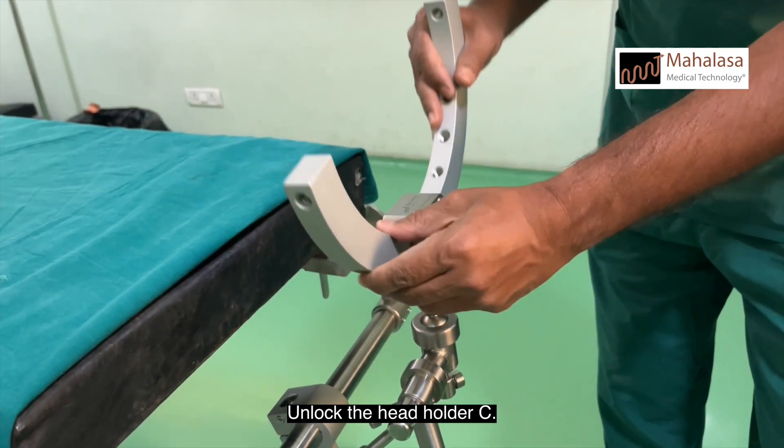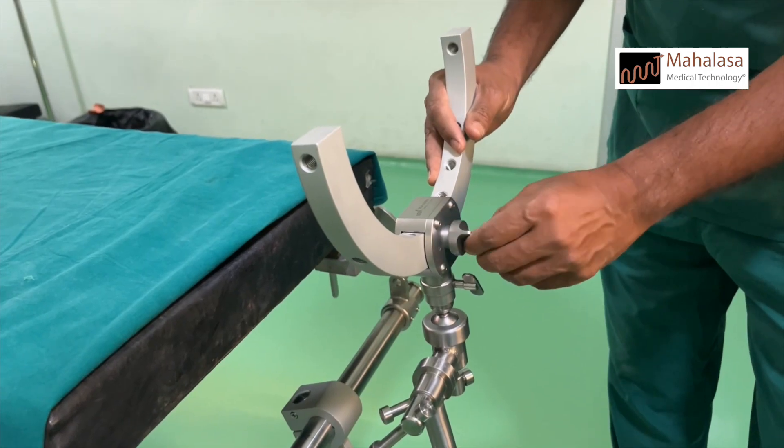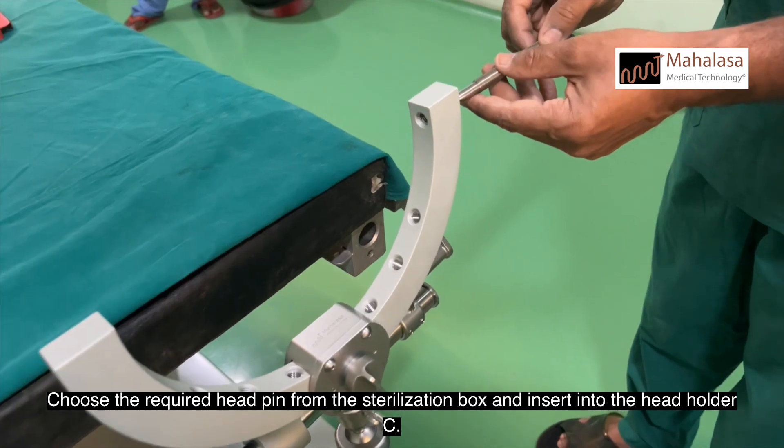Unlock the head holder C, position the C as required, and lock the key. There are three different types of head pins: adult, adolescent, and pediatric. Choose the required head pin from the sterilization box and insert it into the head holder C.